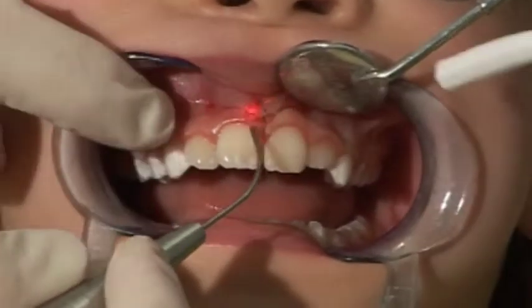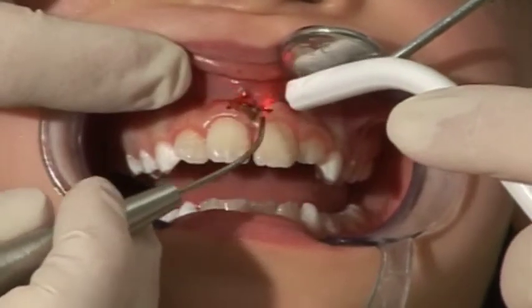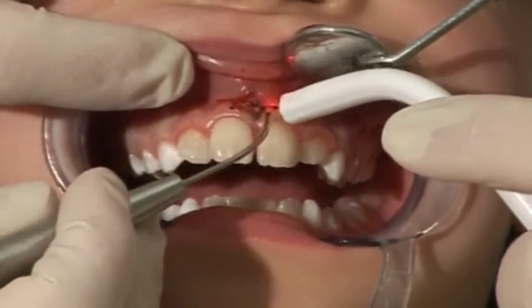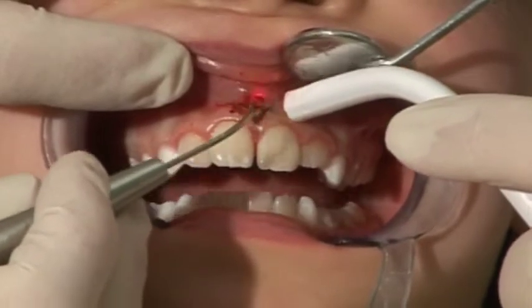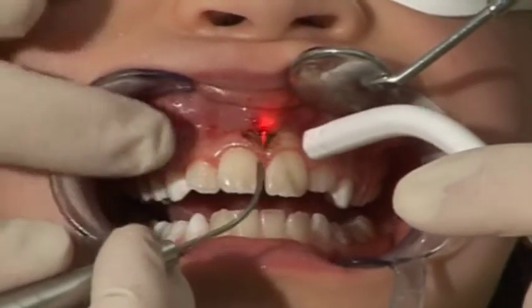Use light pressure and guide the fiber as parallel as possible to the skin surface so that you never go toward the bone at a 90 degree angle. You will make continual contact with the tissue bands so that you feel that all bands have been cut through.